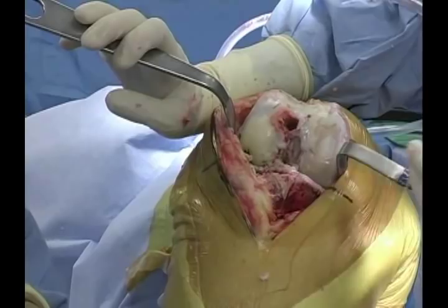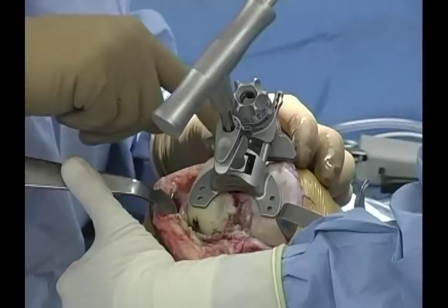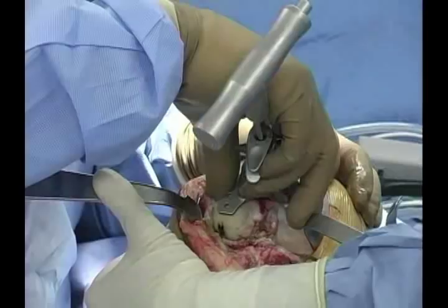The varus/valgus angle is set on the distal part of the guide, and the depth of resection is set on the superior part of the guide in one millimeter increments by click.